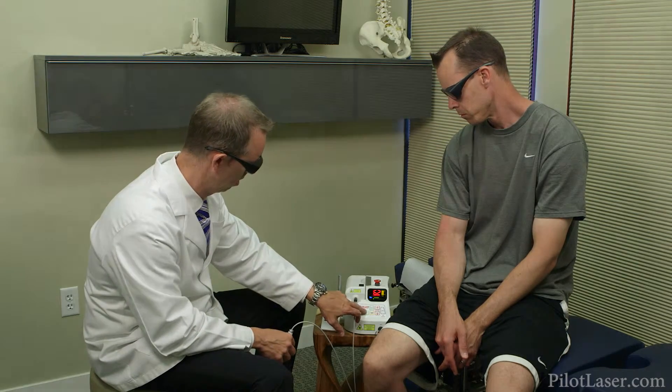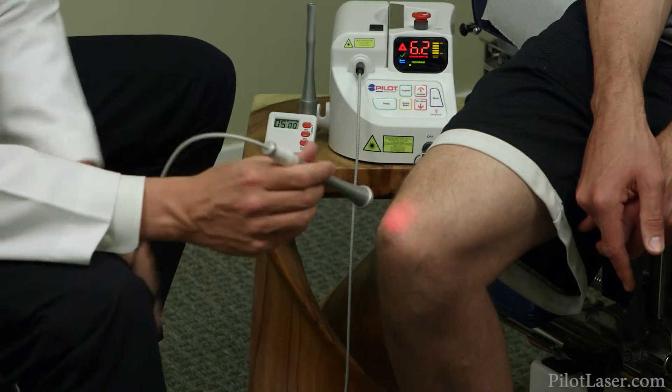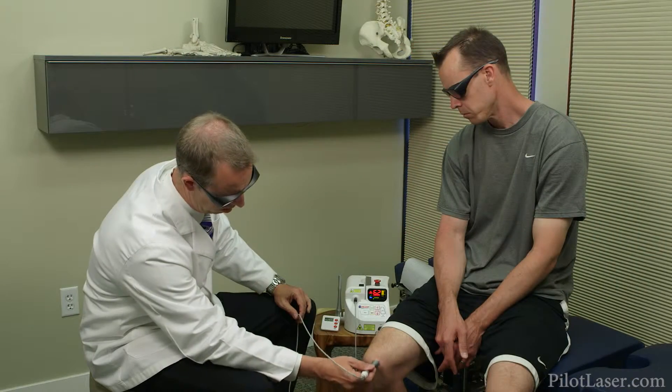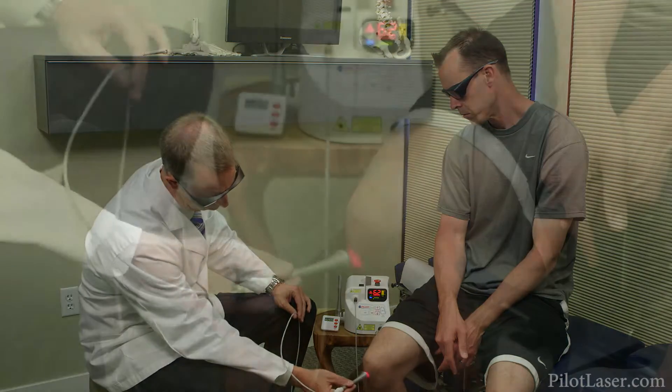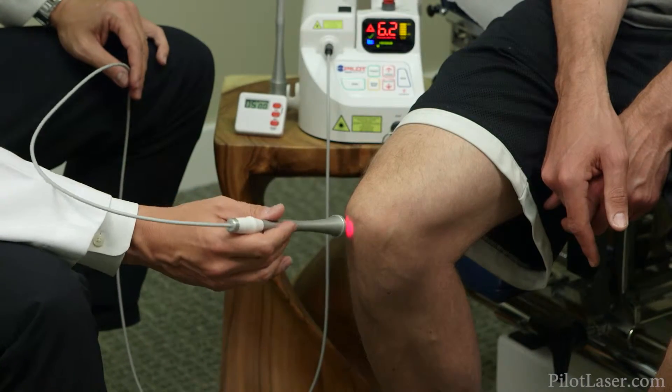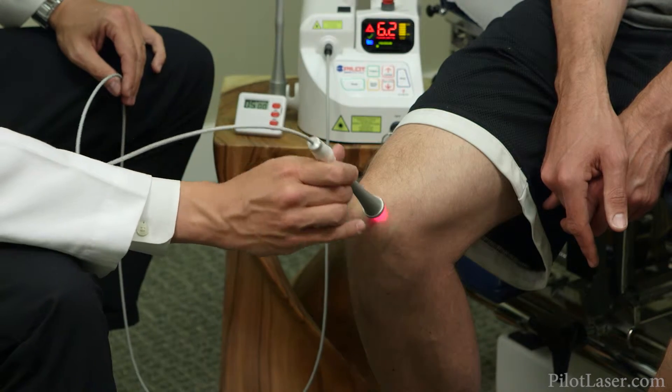To effectively treat Jim's tendonitis, you'll want to run the laser over the spot where pain originates, but also around that area, spreading the energy over an area roughly the size of a standard playing card. When you're assessing the area to be treated, it is important to factor in at least one playing card width around the margin of the pain.